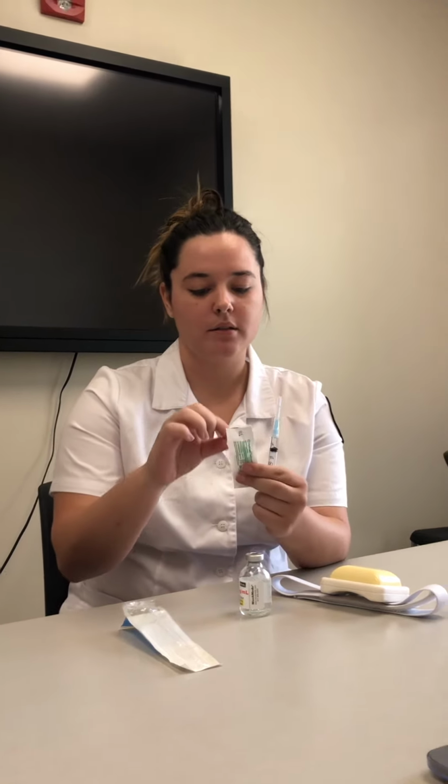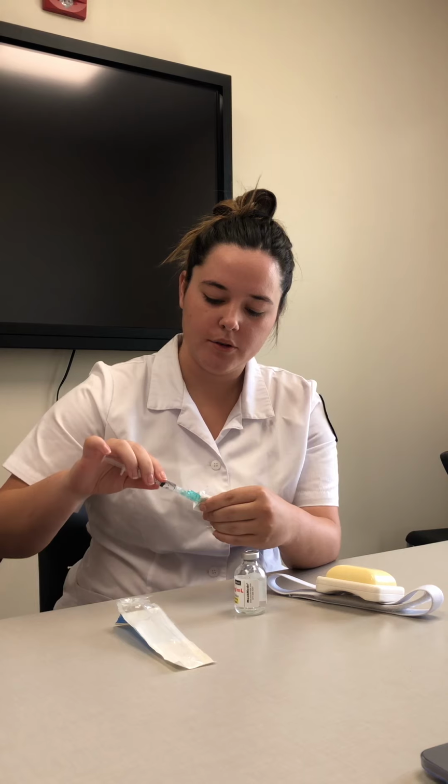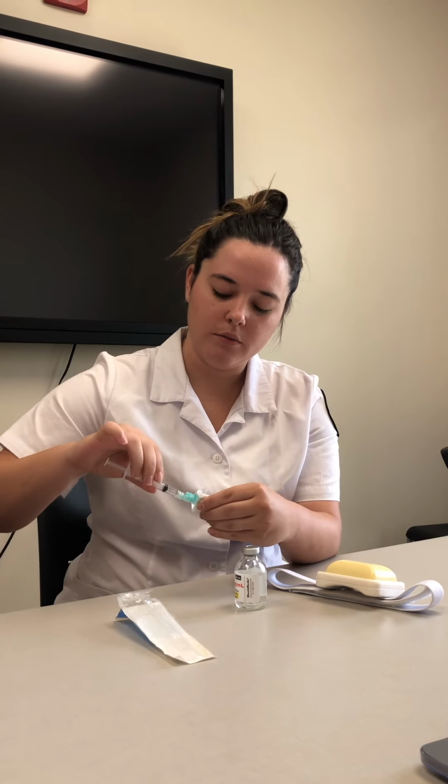And then we need to change out this needle with the intramuscular needle, 21 gauge. So we would sterilely open this, making sure not to touch it. And we're going to carefully take off the needle that's on, put this in the sharps, and screw in the new needle.